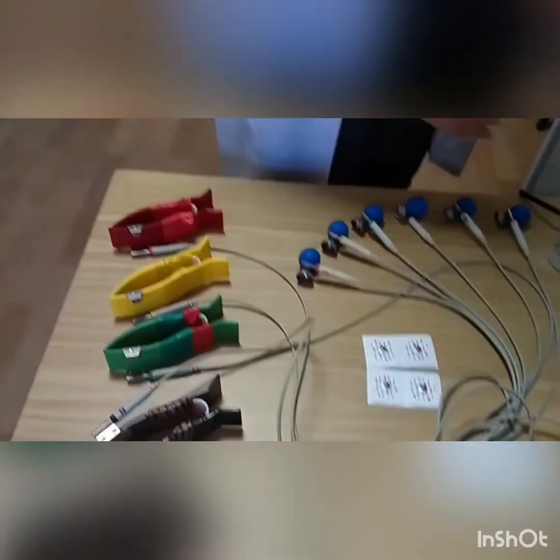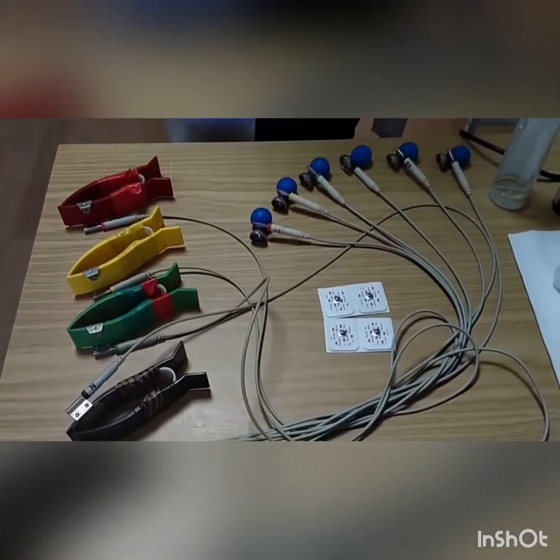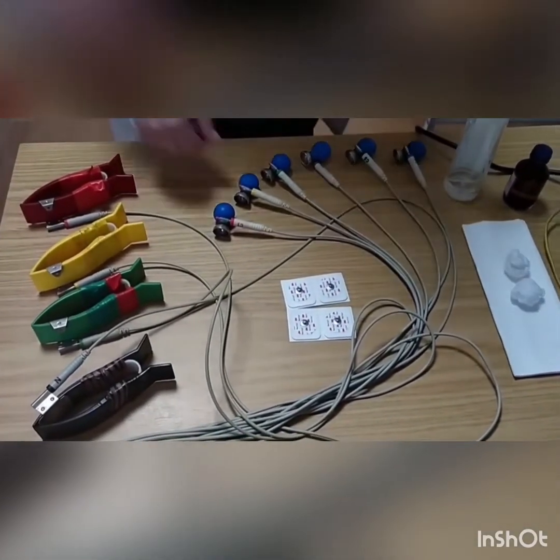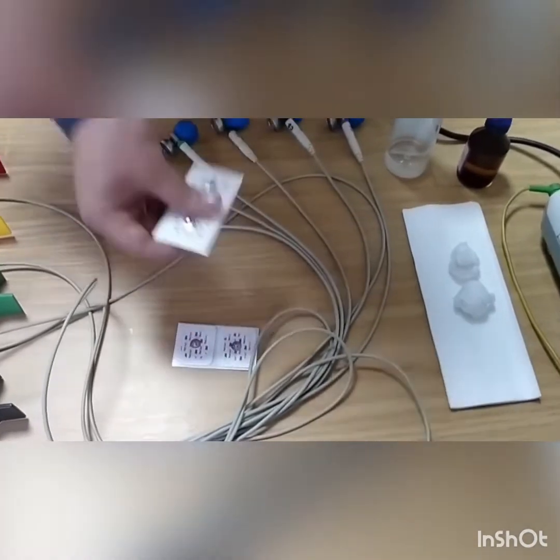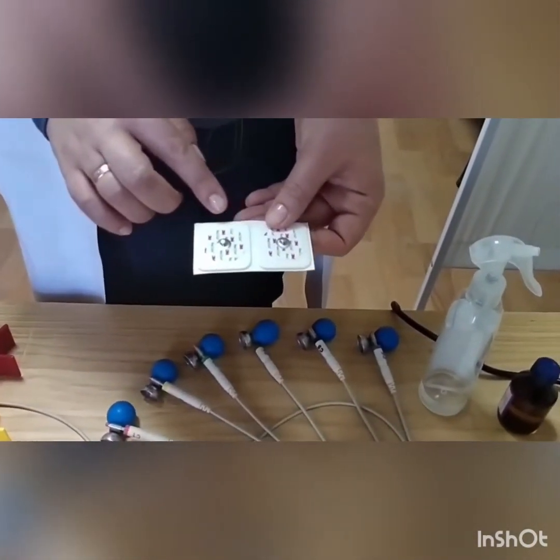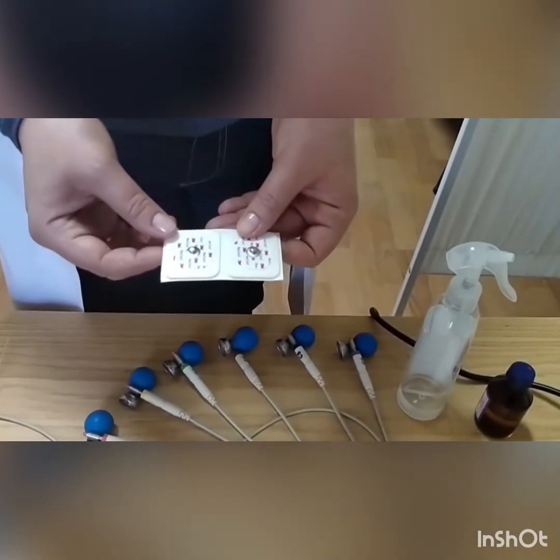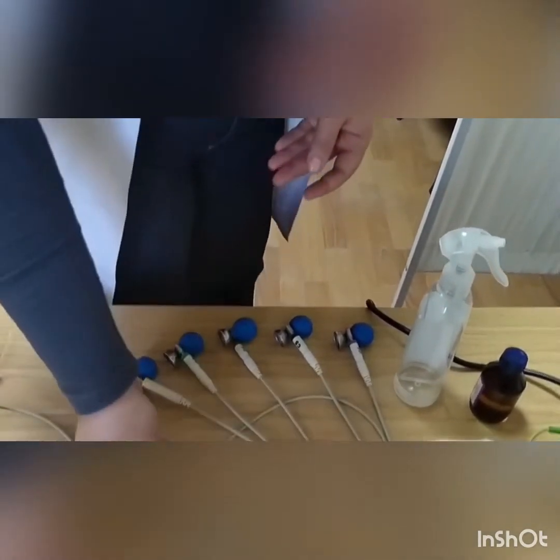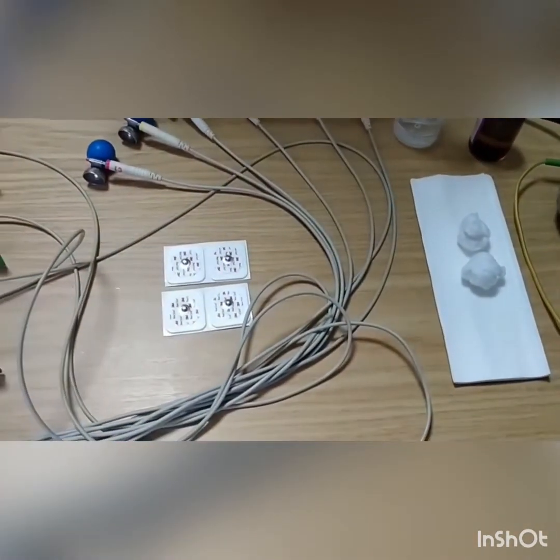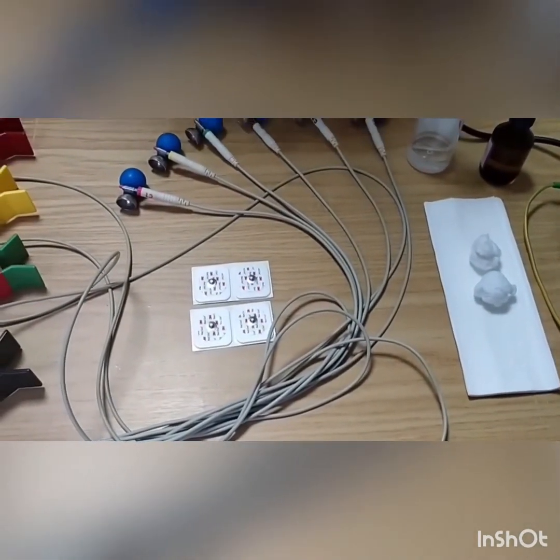Clip electrodes and suction cup electrodes are reusable electrodes. But in recent years, we have been using latex disposable electrodes. For children, electrodes of 32–36 mm are used. For older children and adolescents, we can use latex disposable electrodes with a diameter of 50 mm.